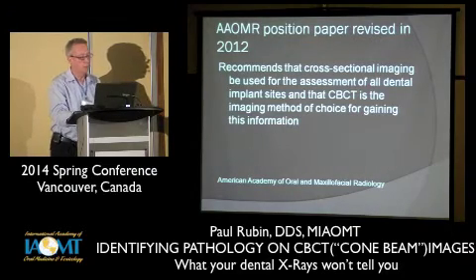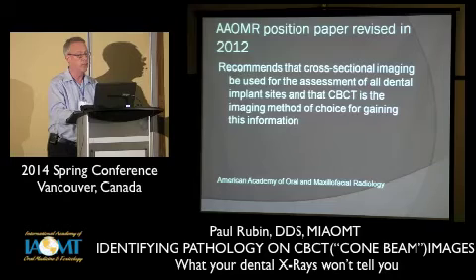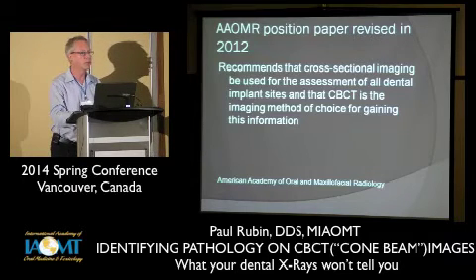The American Academy of Oral and Maxillofacial Radiology recommends that cross-sectional images be used for the assessment of all dental implant sites, and that cone beam is the imaging method of choice for gaining this information. So really, for implant planning and implant placement, this is now state of the art. And if you're not looking three-dimensionally at images, you may be in a bit of trouble.